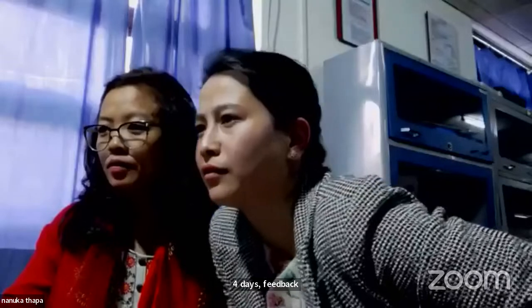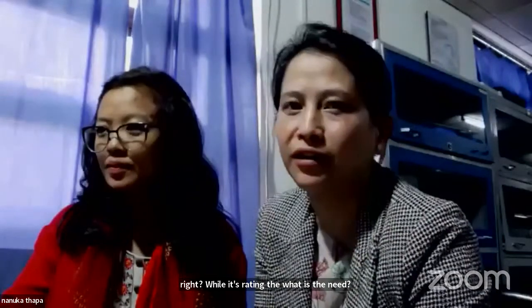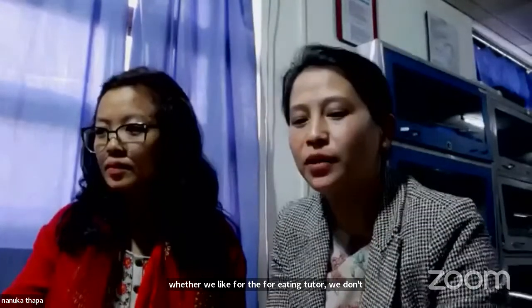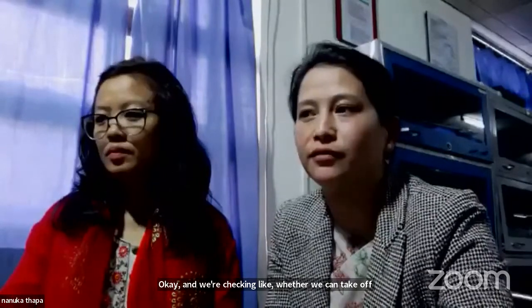While deflating the cuff, what needs to be checked? So why do we deflate the cuff in the first place? For an ET tube, we don't deflate it. But if it is a tracheostomy tube, when we deflate the cuff, it means we're allowing the patient to speak, and we're checking whether we can take the patient off the tracheostomy tube. These are the reasons why we deflate the cuff.